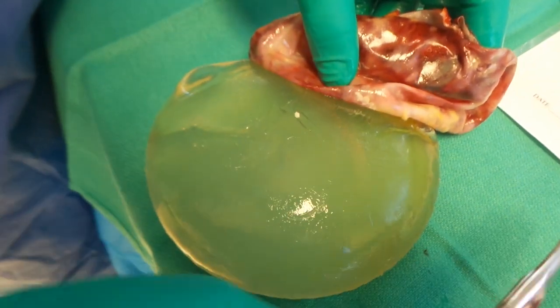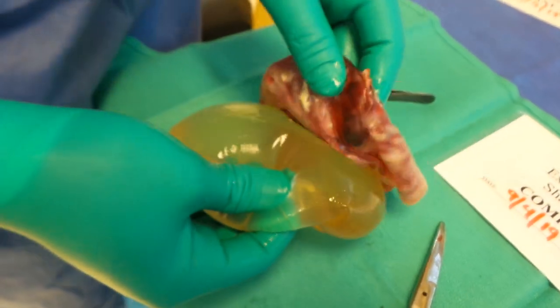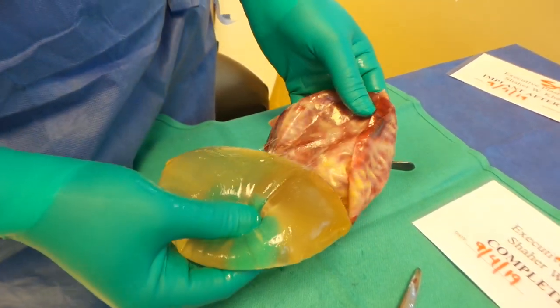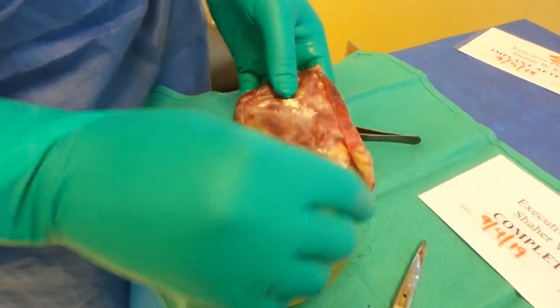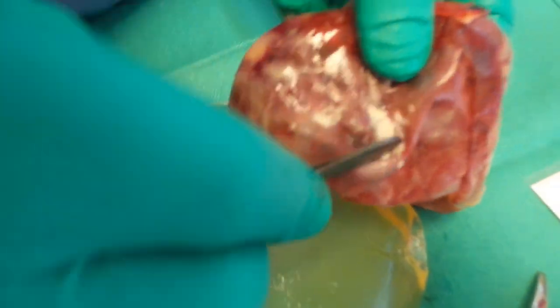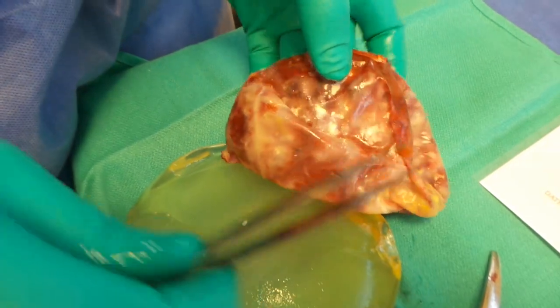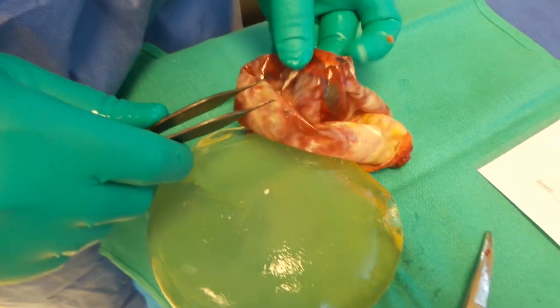Believe it or not, this is a leak — this is an implant that was ruptured. It was removed en-bloc, and as you can see, there is no spillage inside the chest cavity. You can see right here this is abnormal silica — crystals of silica that have formed with a very abnormal consistency.